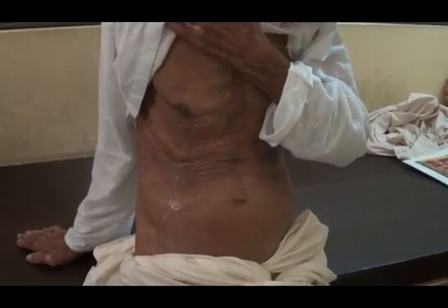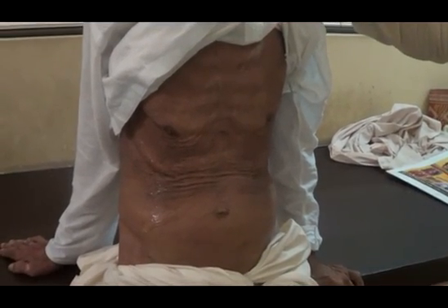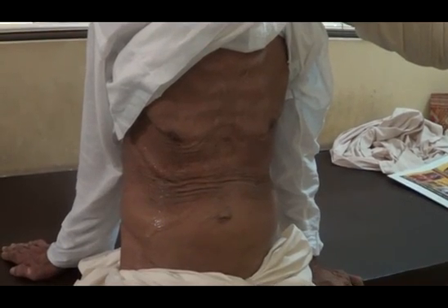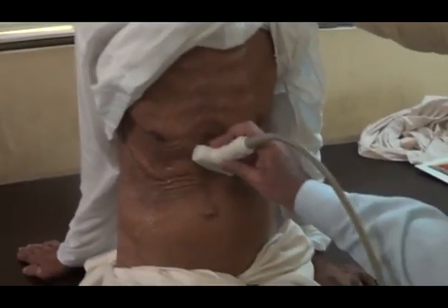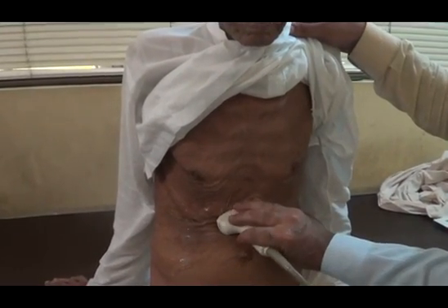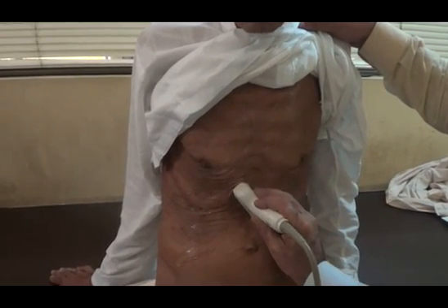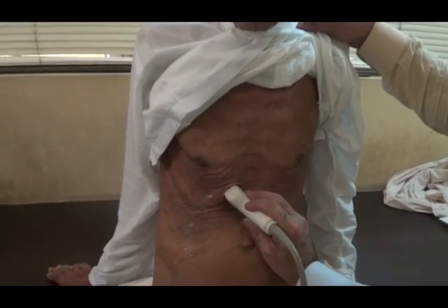in case you are not getting the gallbladder or the common bile duct in supine or in left lateral decubitus posture, if the patient can stand up and stand for a while, scan in this posture so that you can get a better idea when the organs come down, regarding all the organs in this region and vessels as well.